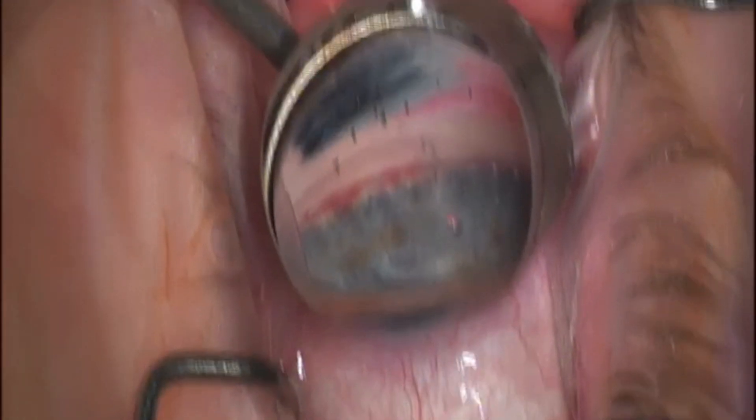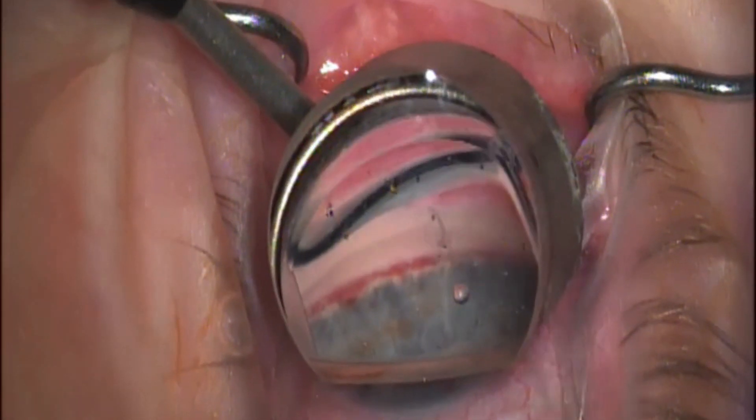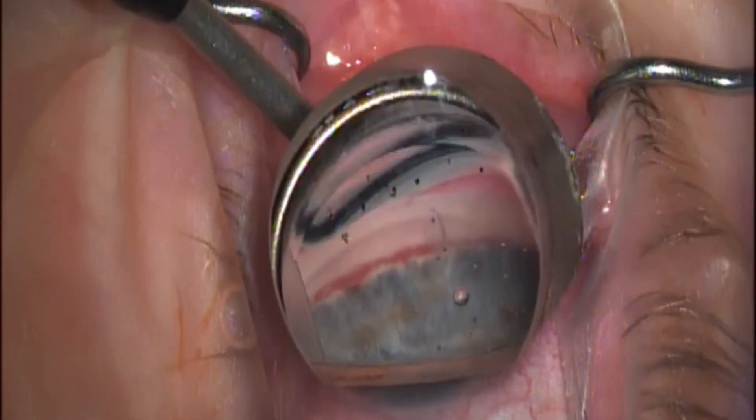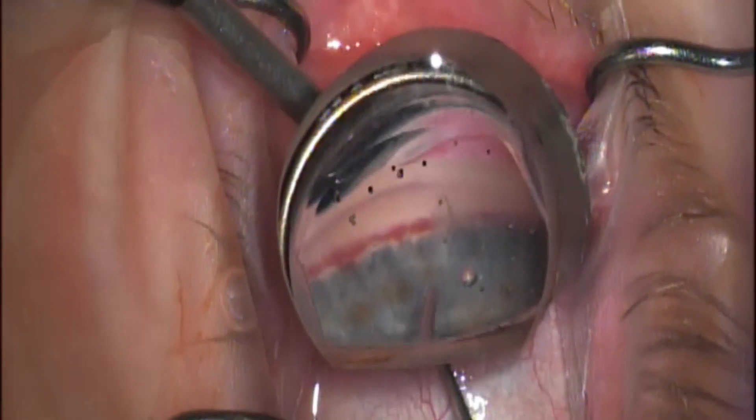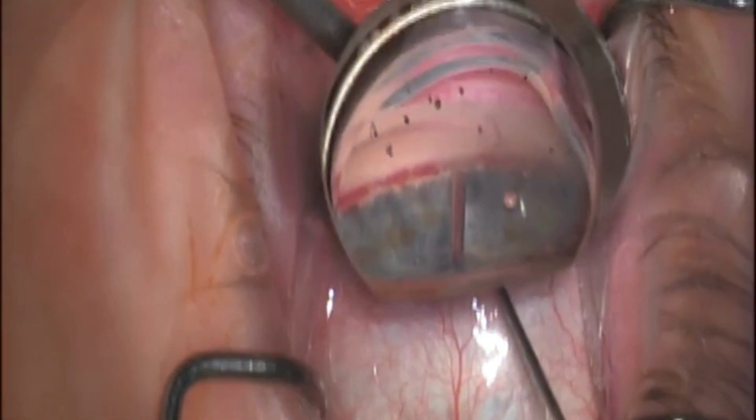This is a nice demonstration inserting the new Aliflow device. What we've done so far is we've deepened the chamber with viscoelastic. I then introduced the actual viscoelastic cannula and I'm going to lightly strum the scleral spur.